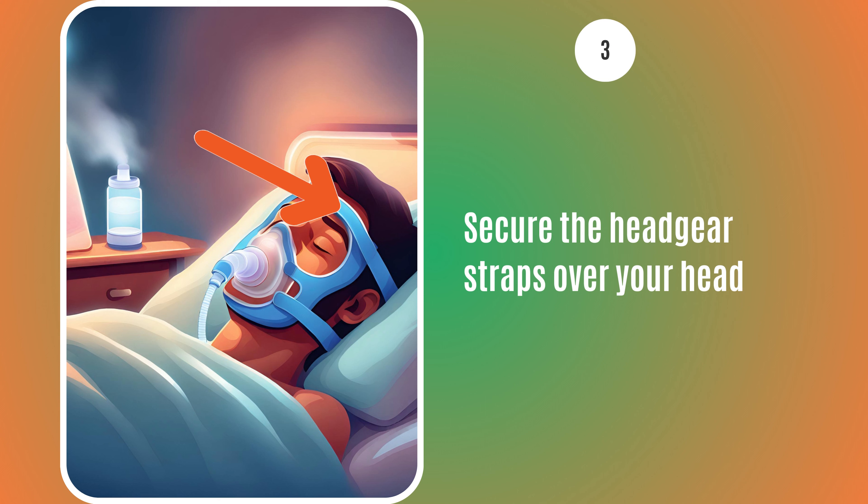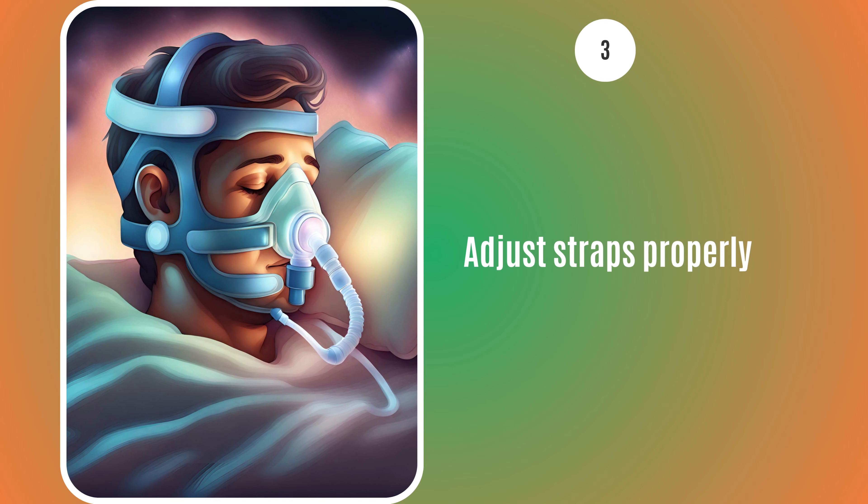Secure the headgear straps over your head. Start with the upper straps and then adjust the lower straps. Make sure the straps are snug but not overly tight, and adjust them evenly to avoid pressure points or leaks.